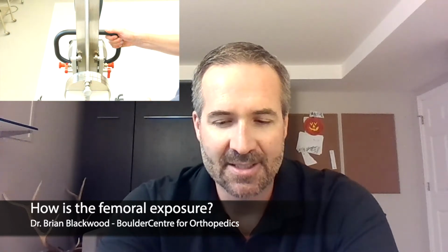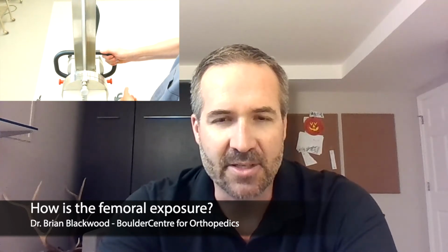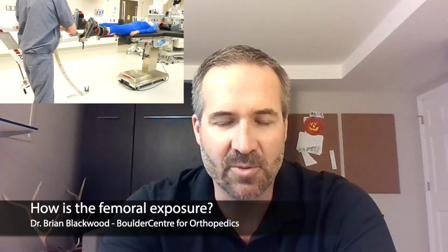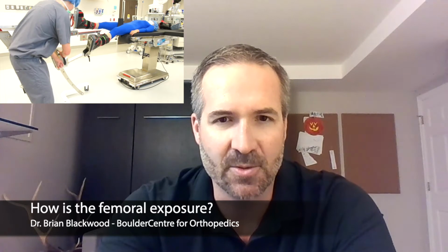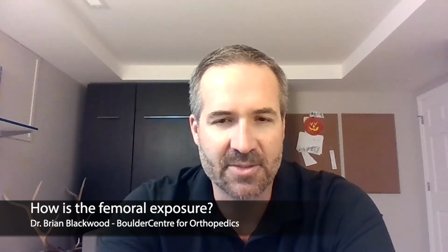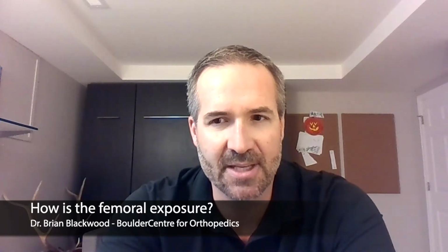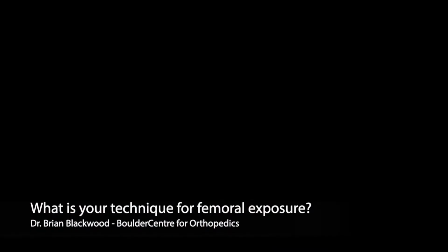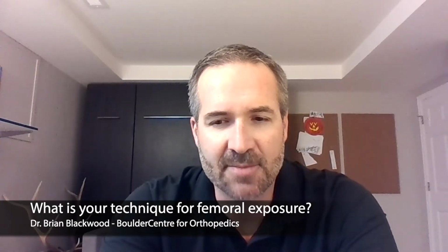We've been able to calculate and sort of meter our delivery of the leg as we drop the leg down, so we can do a measured release and release just the tissues that are holding us back, so we can get excellent exposure. We've even been able to do restoration modular revision cases through the anterior approach using the arch table with little difficulty.